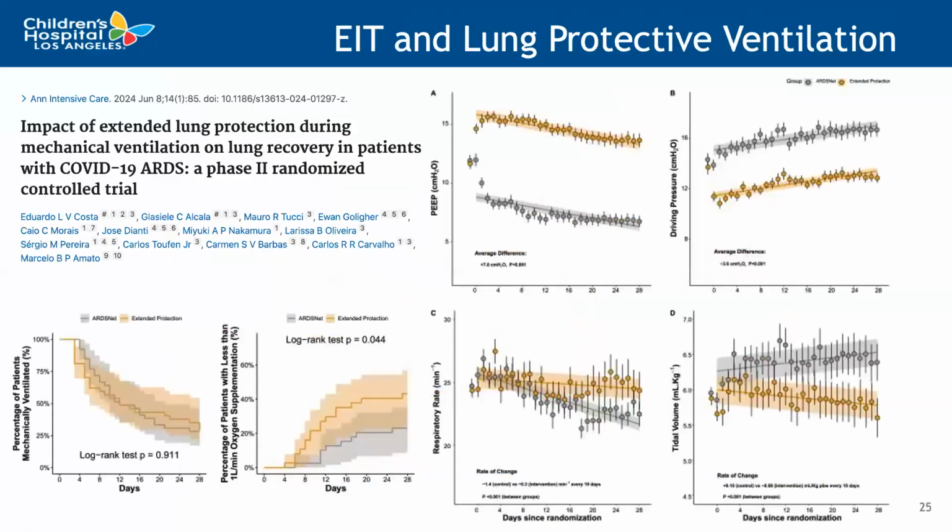And so how is EIT helpful in guiding these lung protective ventilation strategies? The same group that we'll talk about later in the study out of Brazil, Dr. Costa and Dr. Amato, are leading the charge with a lot of this EIT research. And they actually performed a phase 2 randomized control trial during the COVID-19 pandemic, in which they randomized patients to a more conventional strategy of following the ARDS guidelines, and then a strategy that was using EIT guided management.